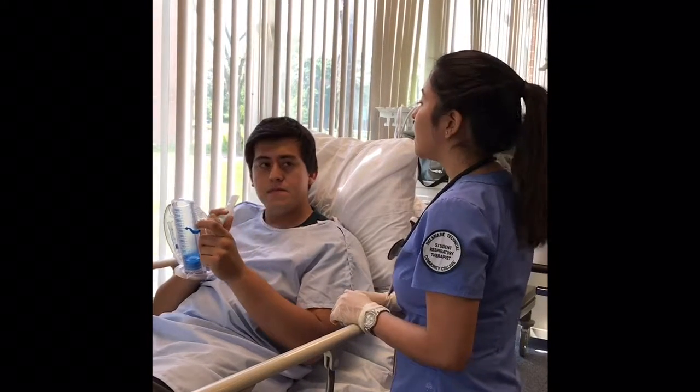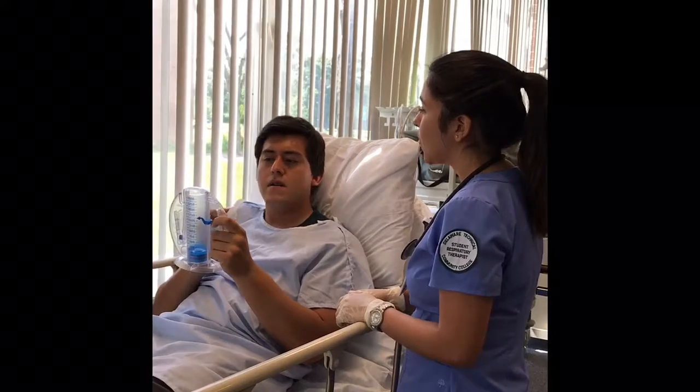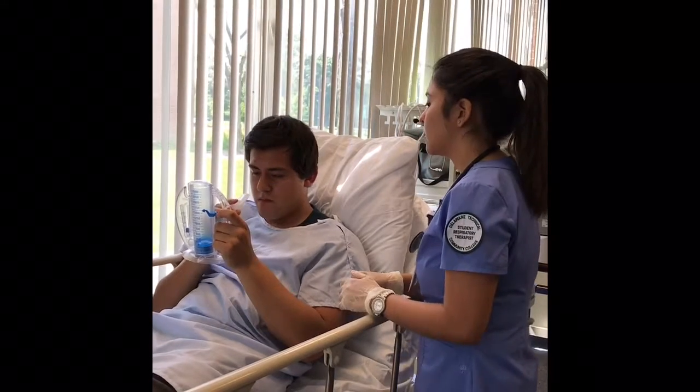That was very good. The only thing that you didn't do was hold your breath, so I'm gonna have you do that again.